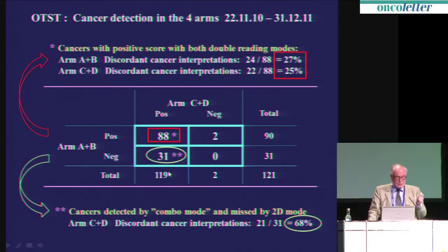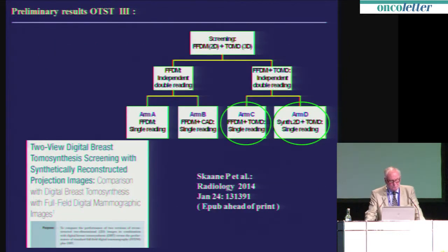It tells you that the perception, detection, and the analysis of these fine additional cancers that you pick up on tomosynthesis are not always so easy. You definitely have a learning curve. It might occasionally be difficult to see: is there a radial architectural distortion, or is it only crossing connective tissue? Do I see it only on one view, or on both views? It is not always so easy. So without doubt, this high discordant rate indicates you have a learning curve regarding interpretation of tomo findings.